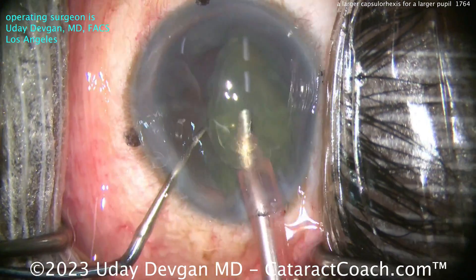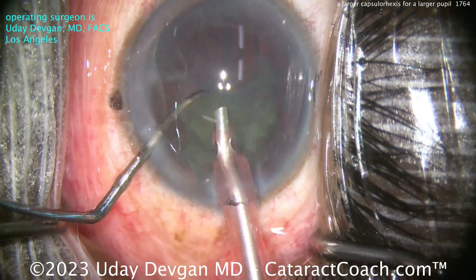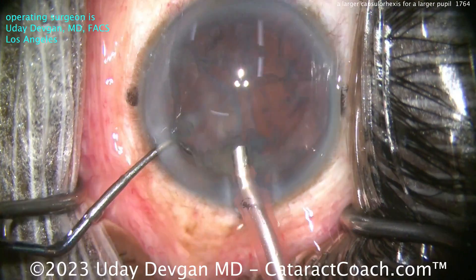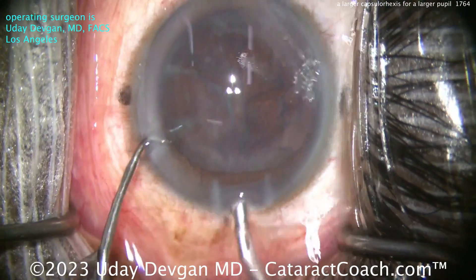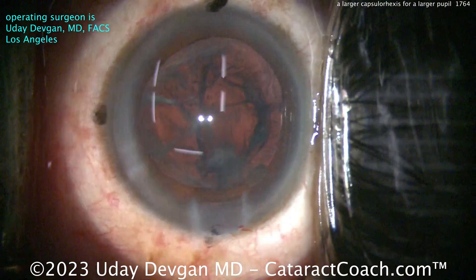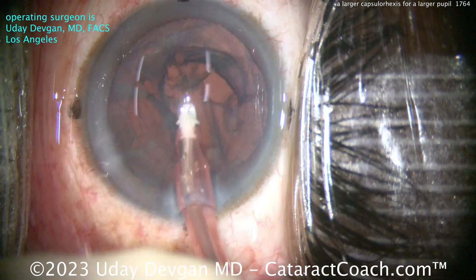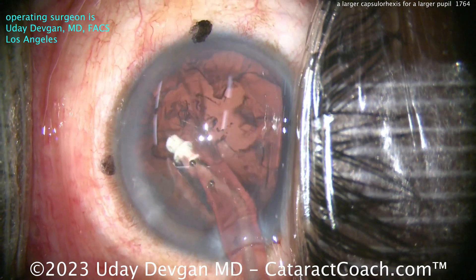If I did a small rhexis in this eye — say a four millimeter rhexis — maybe that would be okay, but it's going to effectively make the pupil size four millimeters. Because remember, the remaining capsular bag that's there is not going to stay totally crystal clear and pristine forever. It may develop a haze to it, so you'll get a relative shrinking of the pupil size. In this situation, the patient understands all the issues. The patient actually has a photography background and desires to stay minus two, really using that large pupil to his benefit.